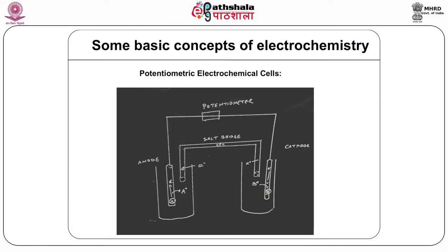The potentiometric electrochemical cell. Figure 1 shows a typical potentiometric electrochemical cell. This electrochemical cell consists of two half cells. Each of these half cells consists of an electrode and a solution of ions. The activity inside the solution determines the electrode's potential. The two half cells are connected by a salt bridge. The main reason for a salt bridge is to avoid the oxidation and reduction reactions taking place at the same electrode. This prevents the movement of electrons from the surface of the electrode, so they pass via the potentiometer. The salt bridge consists of an inert electrolyte. The salt bridge ends are fixed with porous frits.